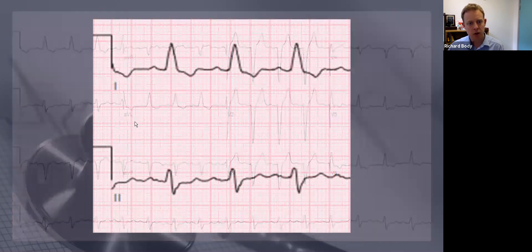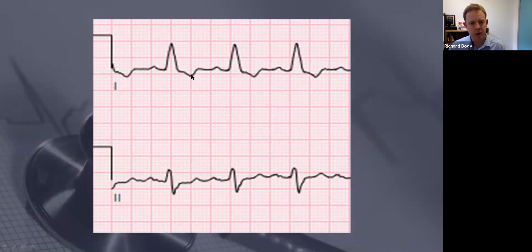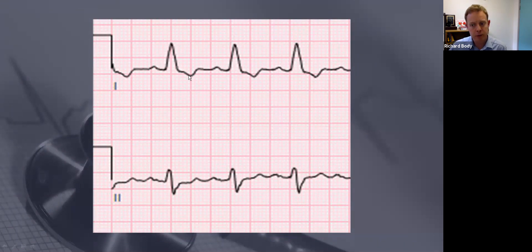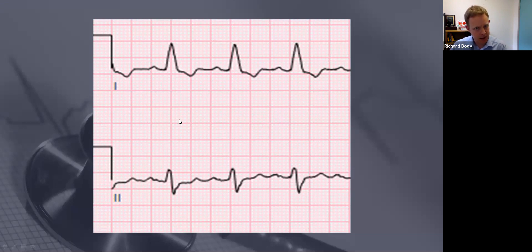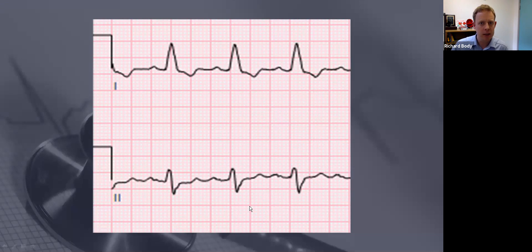Have a look at the axis. For the axis we need to look at leads 1 and 2. We'll see they're going upright in lead 1, which is what we're supposed to see - so that's normal. But if you look at lead 2, the S wave is deeper than the R wave, so it goes more down than up. That means it's an abnormal axis - left axis deviation.